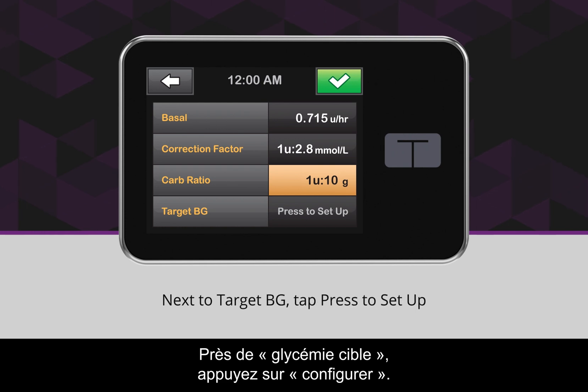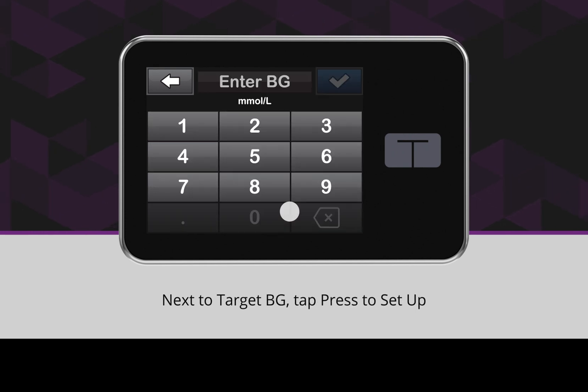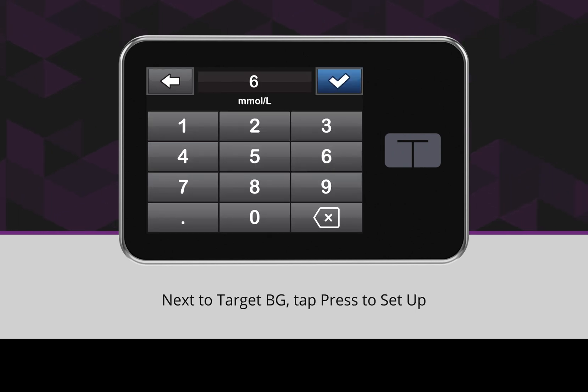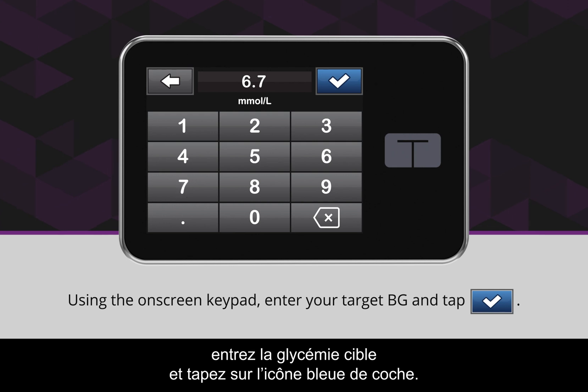Next to Target BG, tap Press to Set Up. Using the on-screen keypad, enter your target BG and tap the blue checkmark icon.